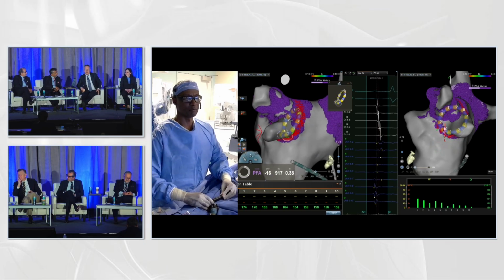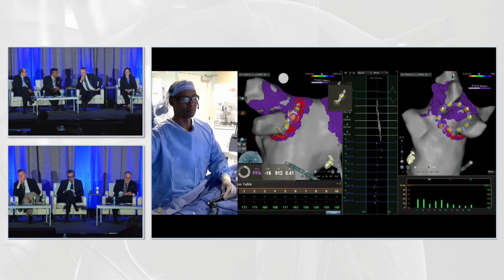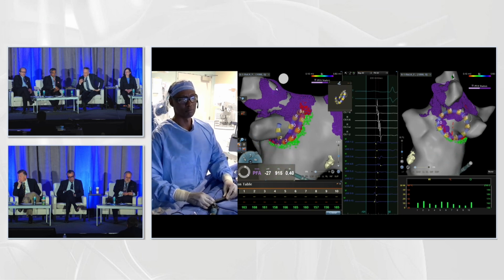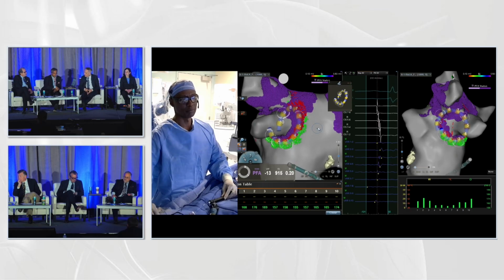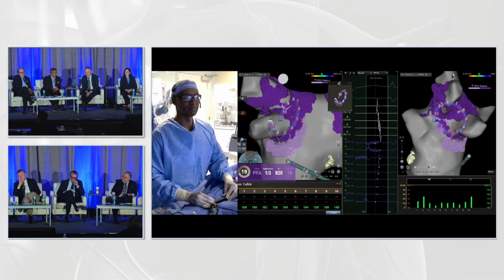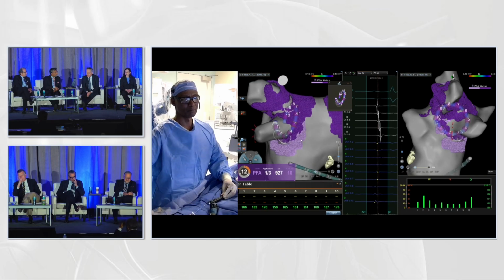Yeah, sure. So first of all, I think this is an ideal candidate. Coming to your question, Luigi, we systematically apply atropine, so I cannot really say anything about vagal responses. I'm not aware of vagal responses in the IDE studies, especially in the European studies we were part of. One thing I'd like to comment on, because this is on everybody's mind when they see this catheter: I know there has been an issue in one specific study here in the US. I want to add that we did not see this in the European experience.